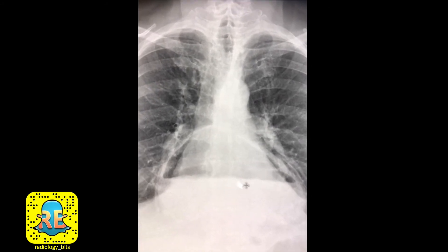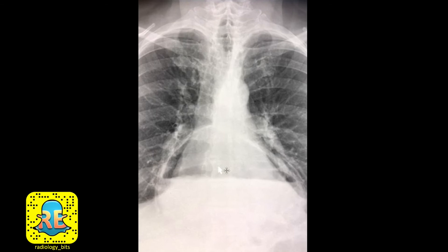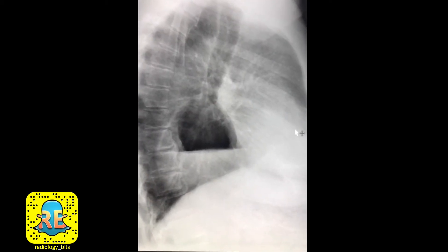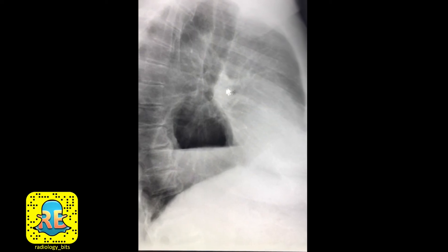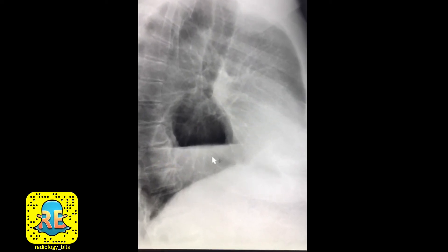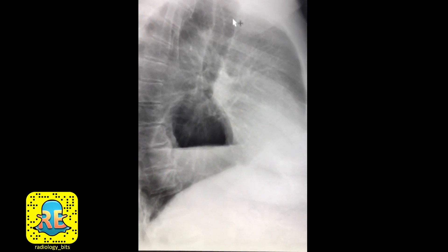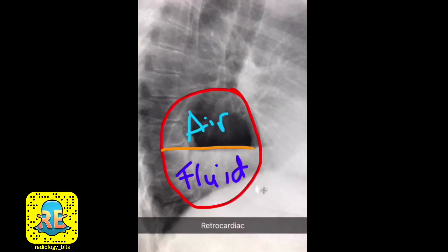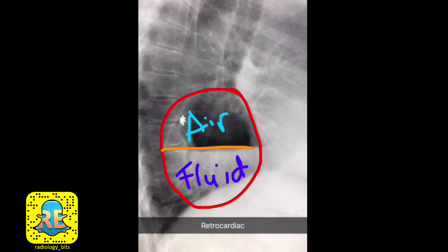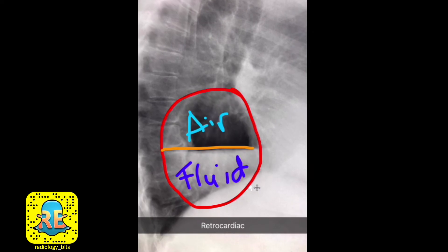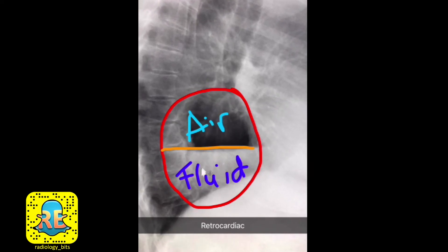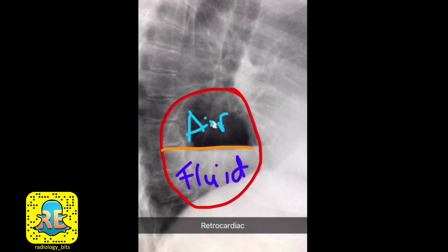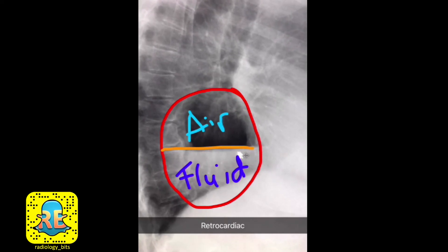We know there is a structure containing air and fluid located either anterior or posterior to the heart, and that's easy to tell by looking at a lateral chest radiograph. On the lateral chest X-ray of the same patient, you see the sternum anteriorly and the spine posteriorly. The white structure is the heart shadow, and here you have the trachea and the arch of the aorta. The abnormality detected on the frontal chest X-ray is located behind — posterior — to the heart; you could describe this as retrocardiac.